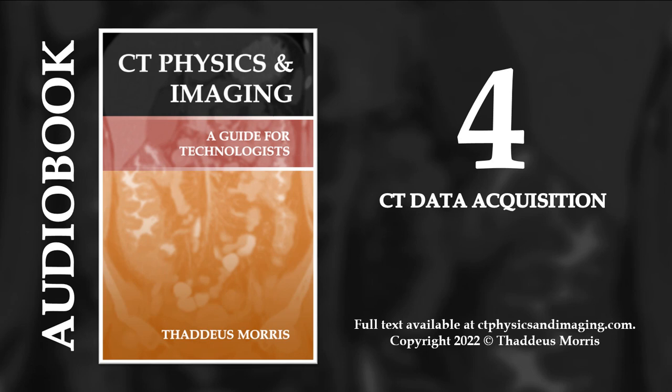So why does pitch matter? If the pitch is less than 1, there is overlap in the helix and the scanner is getting extra views of each body section. This results in a very slow scan with very high spatial resolution. If the pitch is equal to 1, there is no overlap in the scan, but there are no missing views either. This is the standard for most protocols. If the pitch is greater than 1, there are missing views in each body section. This results in a faster scan with lower spatial resolution.